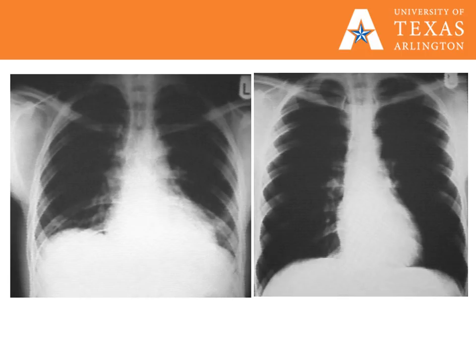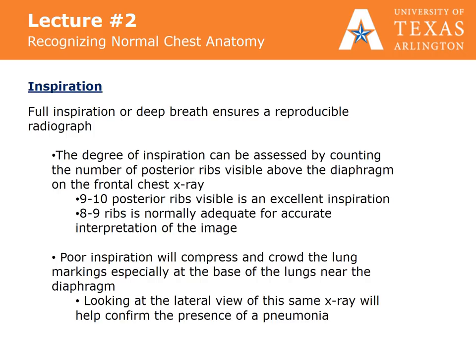These films are both overexposed, but the left is a poor inspiration and the right is just an overexposure. Full inspiration or a deep breath ensures a reproducible radiograph. The degree of inspiration can be assessed by counting the number of posterior ribs visible above the diaphragm on the frontal chest x-ray. Nine to ten posterior ribs should be visible for a good inspiratory film. Eight to nine ribs is normally adequate for accurate interpretation of the image. Poor inspiration will compress and crowd the lung markings, especially at the base of the lungs near the diaphragm.